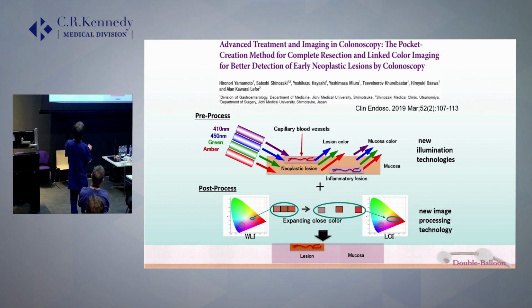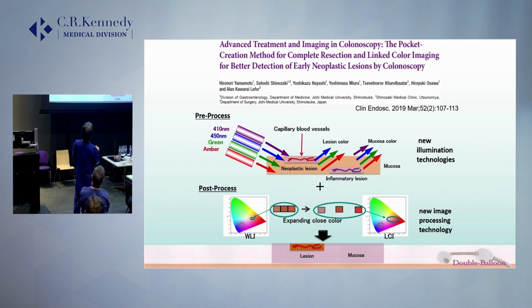This is RGB, red, green, blue, in addition to 3 colors. We use 410 nanometer wavelengths light, and it can penetrate only for a short distance from the mucosal surface.